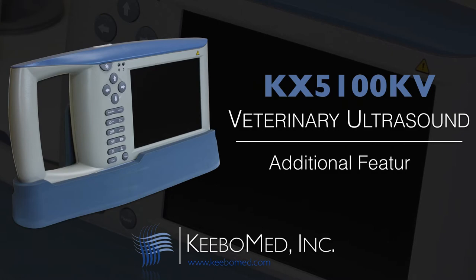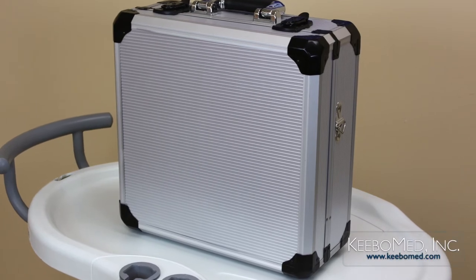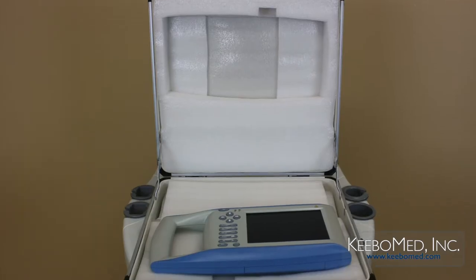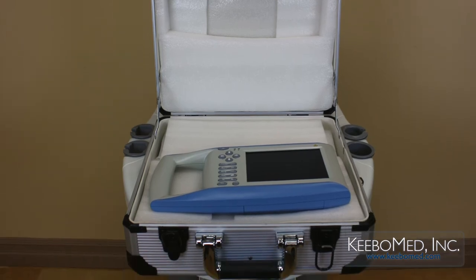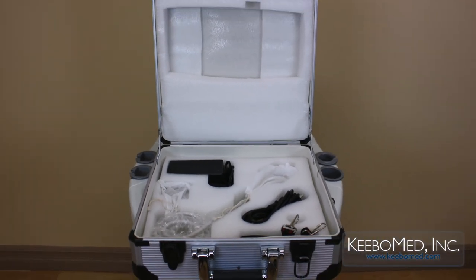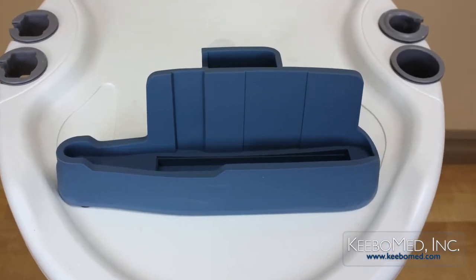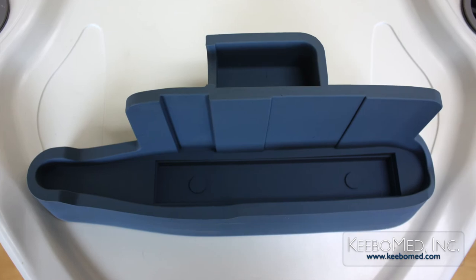Some additional features included with the 5100KV are a durable carrying case that will neatly organize the main unit and its accessories. It also includes a stand to use the ultrasound on a tabletop rather than being handheld.